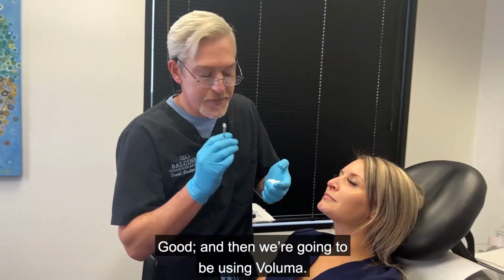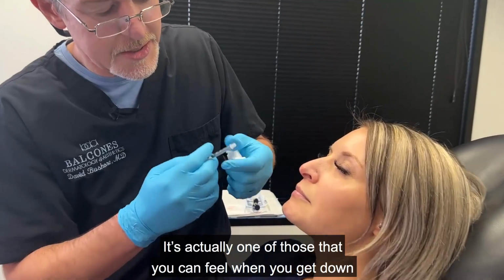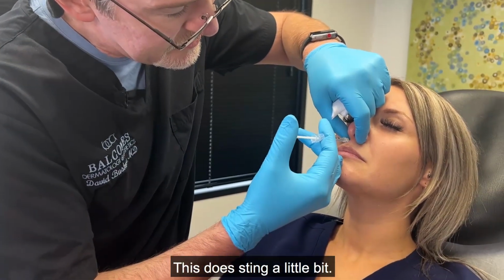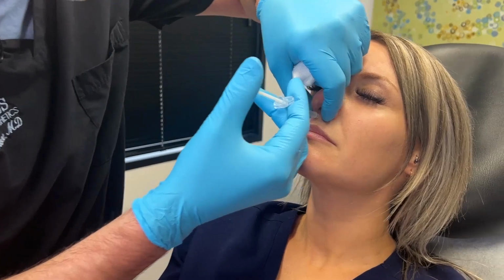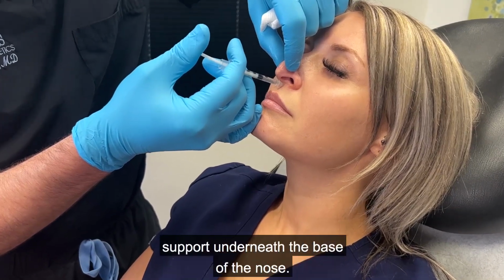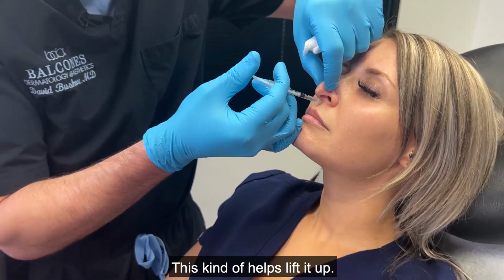Good, and then we're going to be using Voluma, and you do want to go to the base of the nose. It's actually one of those that you can feel when you get down to the bone that's down here. This does sting a little bit. Right down here. Good. You okay there? Yes, sir. Okay. So we're injecting Voluma, and we're trying to provide support underneath the base of the nose. This kind of helps lift it up.